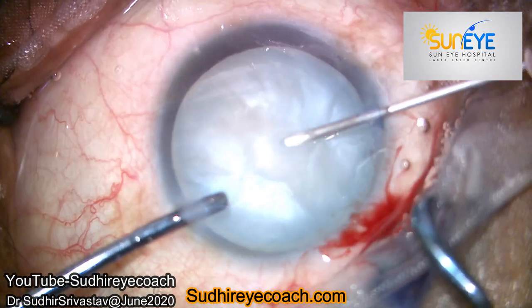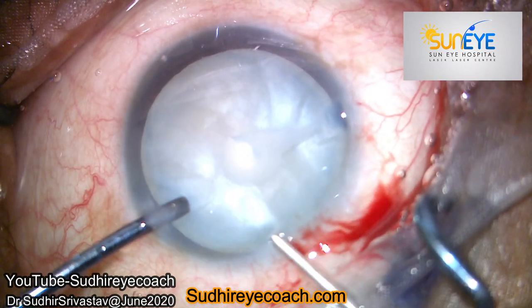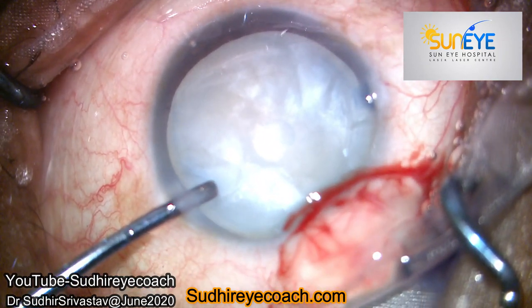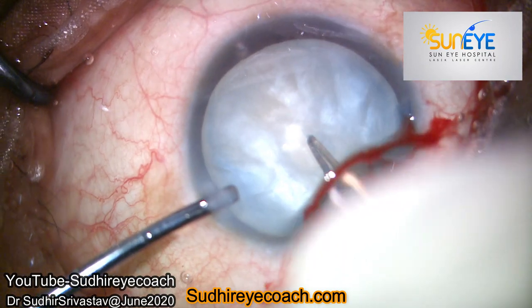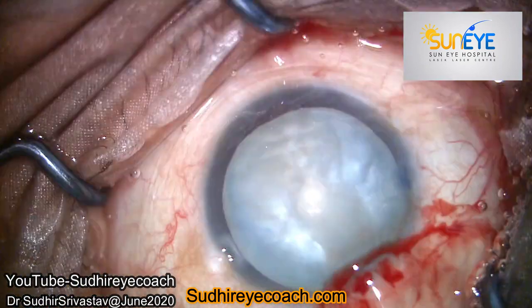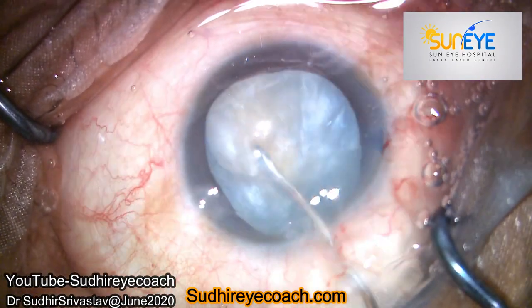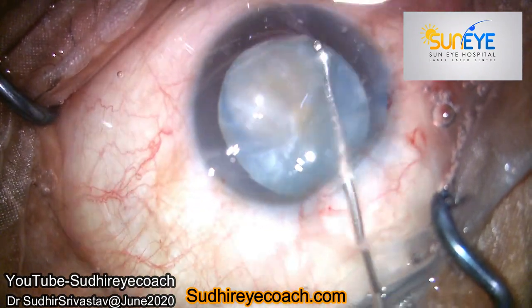There are several ways to decompress the lenticular pressure. I found that making a small rhexis works well in the majority of my cases. Here I made a small opening — although it is not round, it is devoid of any acute angles. I then took time to flush the capsular bag with BSS using a blunt cannula.